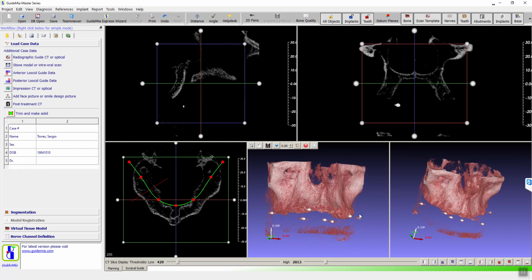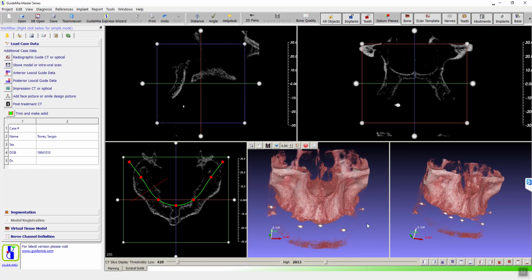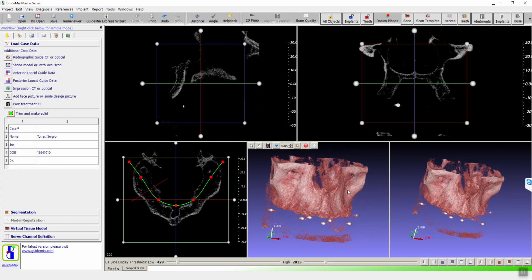As a guideline, when we make radiographic guides, we want the markers to be not evenly distributed, not symmetrically placed. In that case, we can better recognize the markers and register them faster. So let's see how it goes for now.